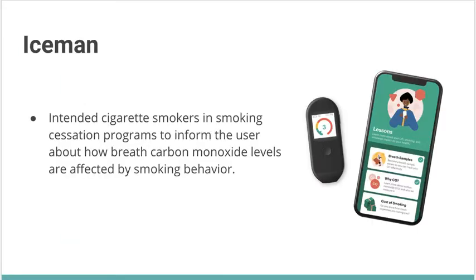However, once the user has actually downloaded the app and paired their sensor, they can watch a 60-second breath sample tutorial video and set up their device by providing a breath sample. Now, keep in mind that this sensor is only intended for cigarette smokers in smoking cessation programs like Pivot to inform the pivoter about how breath carbon monoxide levels are affected by their smoking behavior.